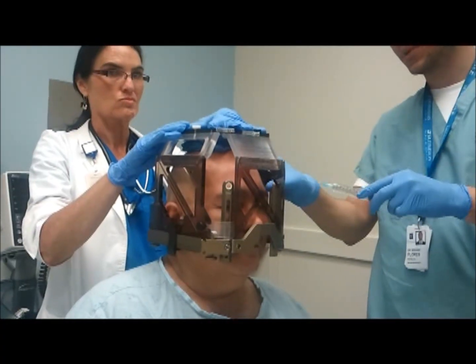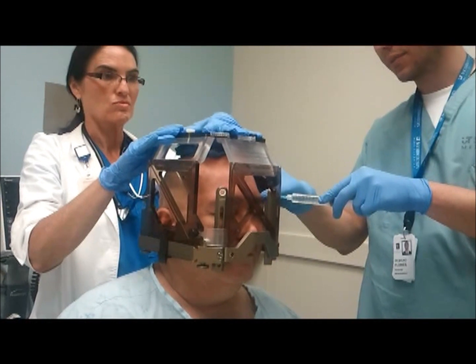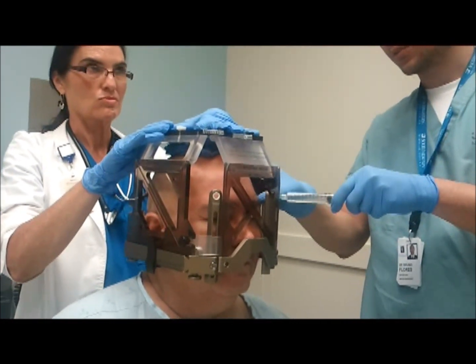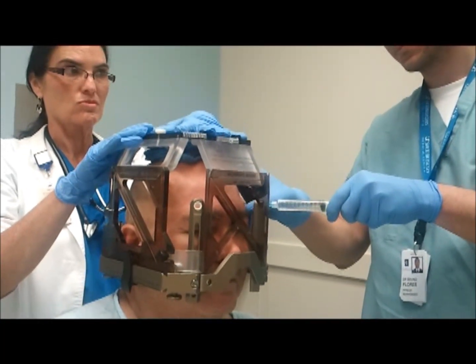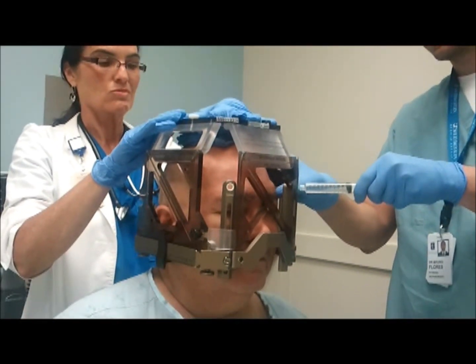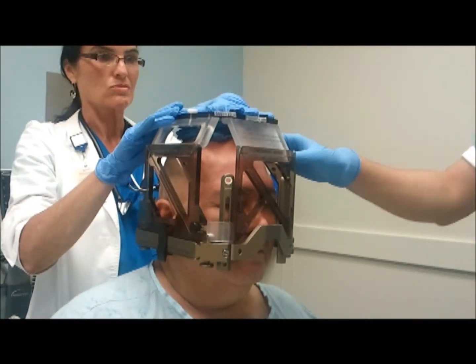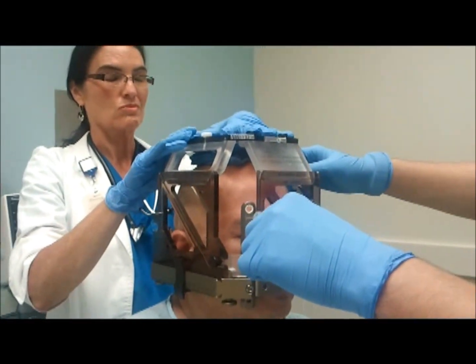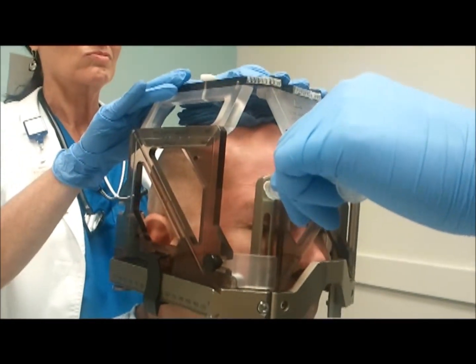We're going to start on the left side here. You're going to have that poke and a burning sensation. First poke here on the left. Once you're through the poke, we're going to start giving you the numbing medicine. One, two, three, and a small poke.